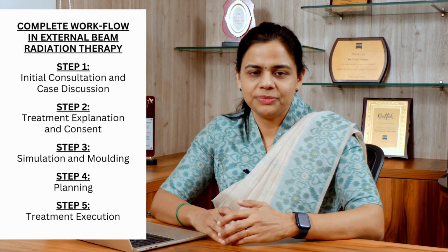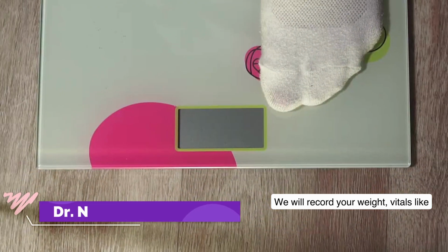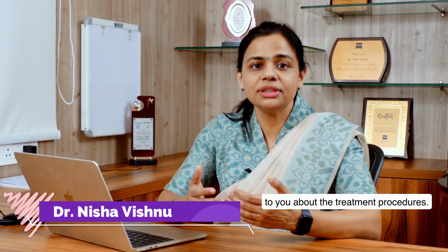Step 5 is treatment execution. On day 1 of your treatment, you will come to the department. We will record your weight, vitals like pulse, BP, etc., and explain to you about the treatment procedures. Positioning will be done by a team of technologists in the same way as it was done on the day of planning, with the exact same accompaniments that we used to position and immobilize you on the planning day.